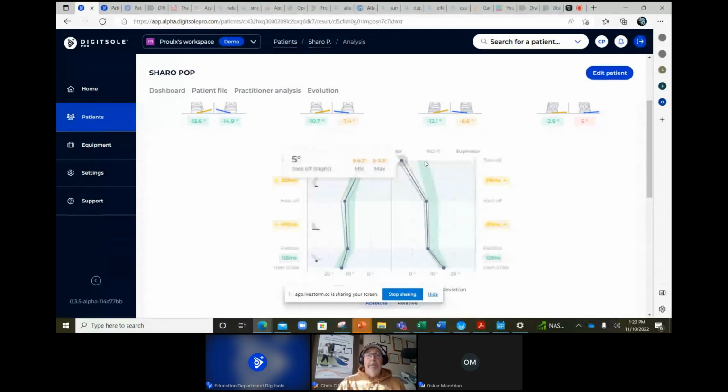Okay. And so what this means is a negative angle on heel strike means that they are on the outside of their foot, right? So that's also known as calcaneal inversion, right? So the bottom of your feet are facing each other. That's going to be inversion.